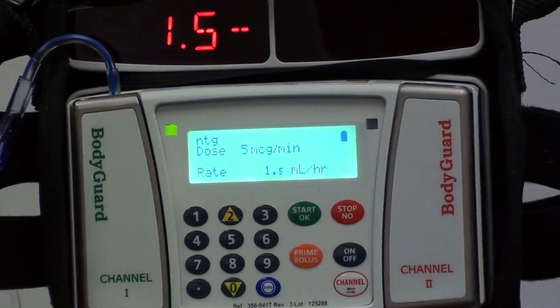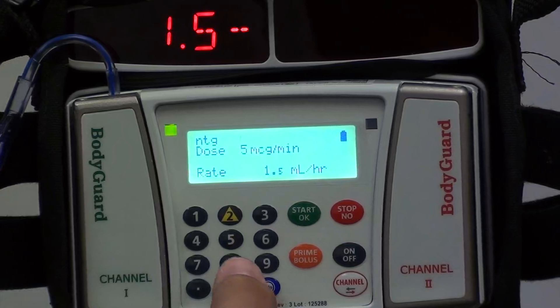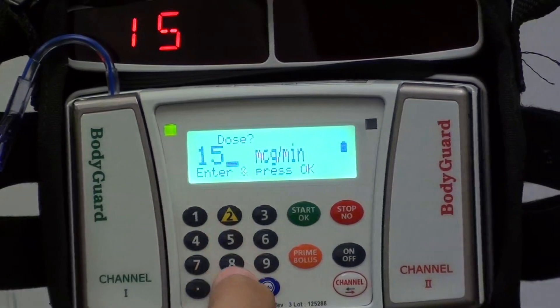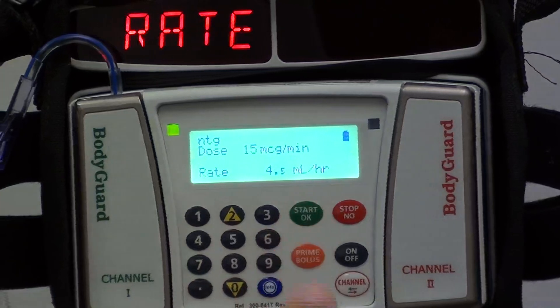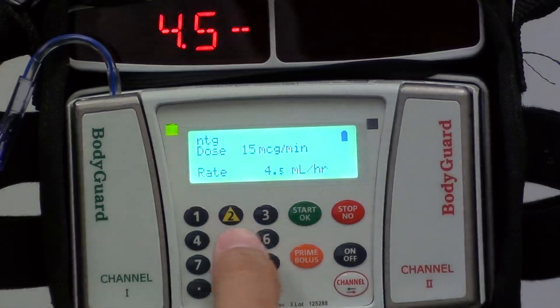You can see on the screen that there's the rate at which you're infusing as well as a spinning section to let you know that the pump is actually working. If you wish to change your dose, you can do so by simply changing it on the screen. So if we want to switch it to 15 micrograms per minute, you just press 15 and hit OK. You'll hear a beep to confirm the change. If you realize that's too much and you'd like to go back, you can do the same thing on the fly.